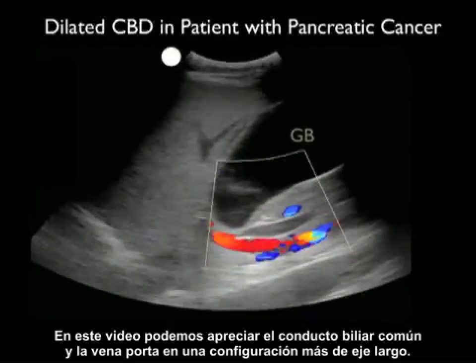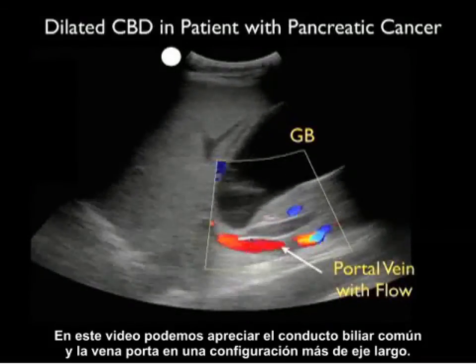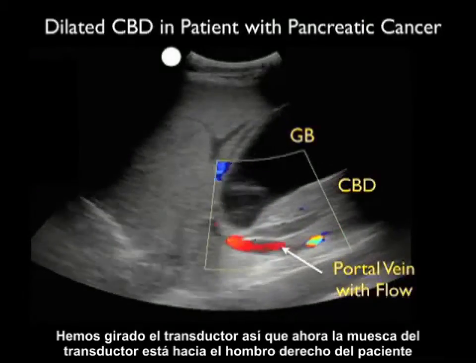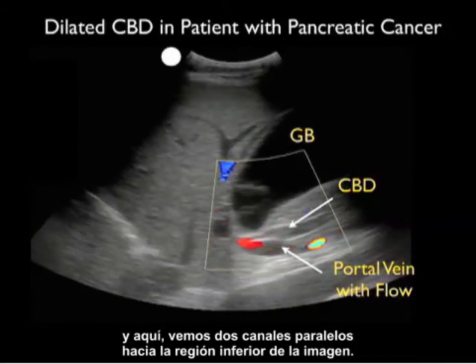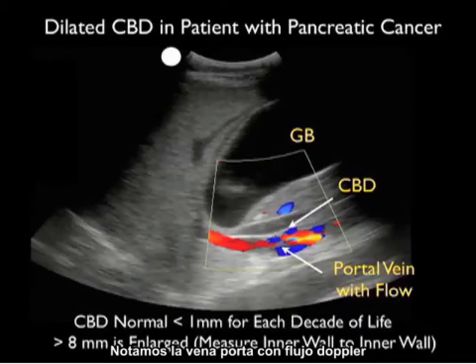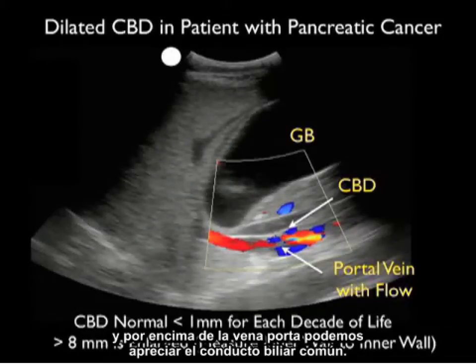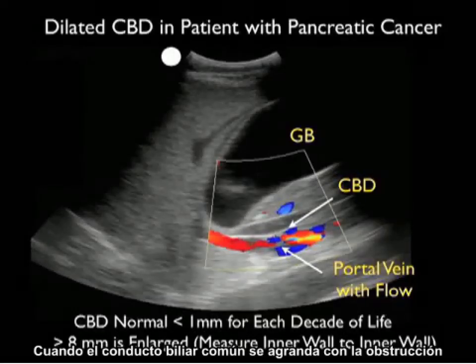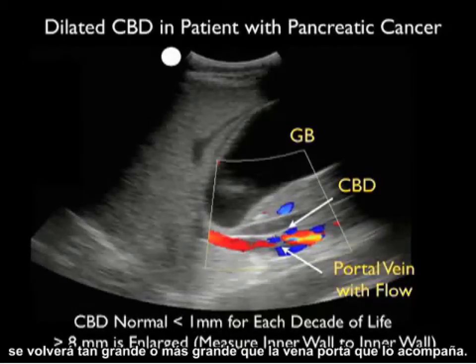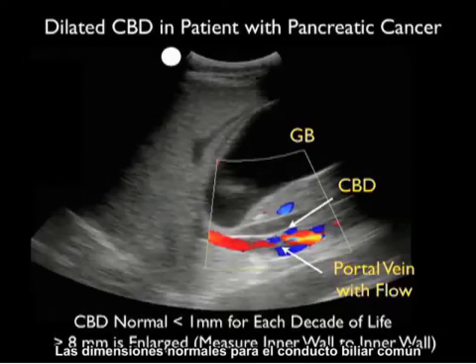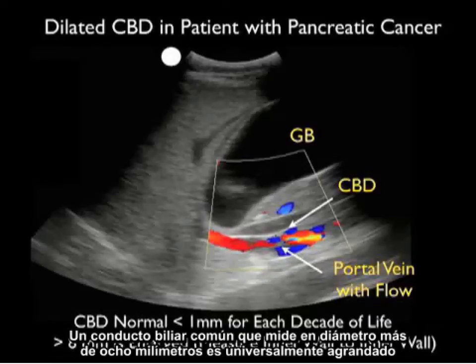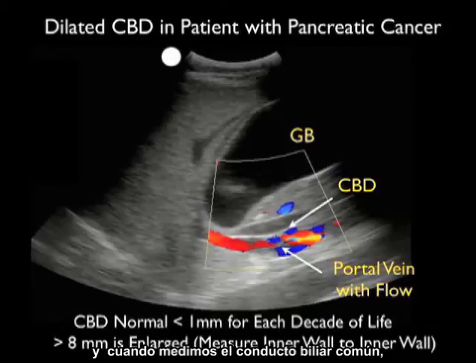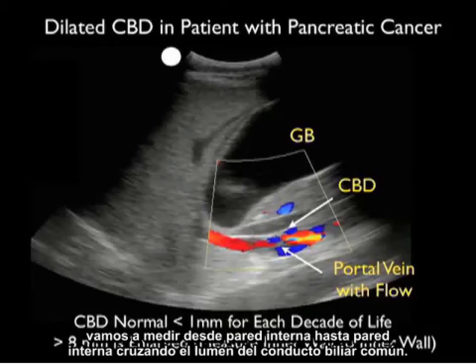In this video clip, we can appreciate the common bile duct and portal vein in a long axis configuration. The probe marker is towards the patient's right shoulder. We see the gallbladder at the top and two parallel channels below — the portal vein with Doppler flow, and the common bile duct on top of it. As the common bile duct enlarges with obstruction it becomes as large or larger than the portal vein. Normal CBD dimensions are no greater than one millimeter per decade of the patient's life. A diameter greater than eight millimeters is universally enlarged, and we measure from inner wall to inner wall.